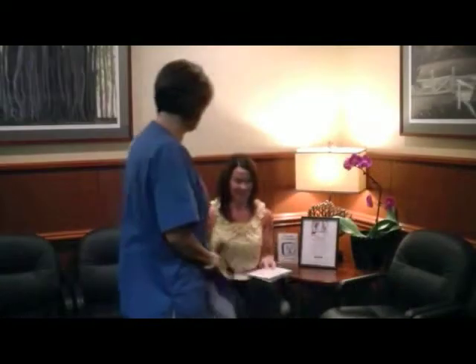Over the next few minutes, I would like to discuss the procedure that we will be performing as well as what to expect during your visit. After checking in with the receptionist, you will be brought to the ultrasound department.